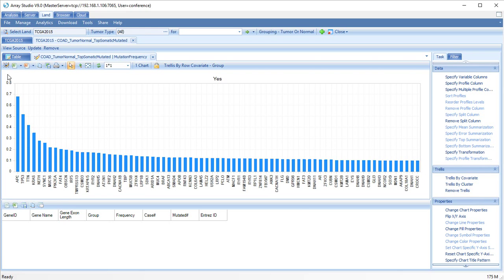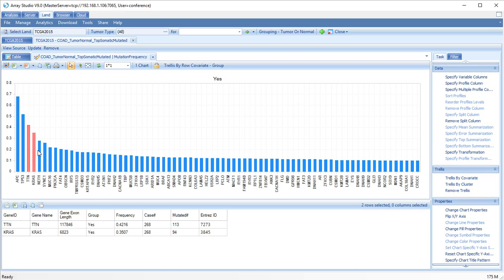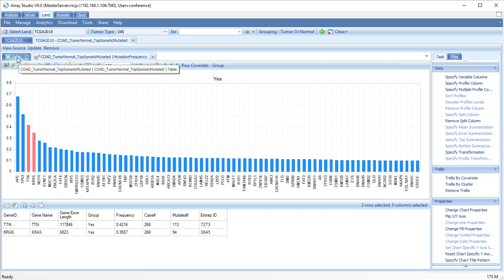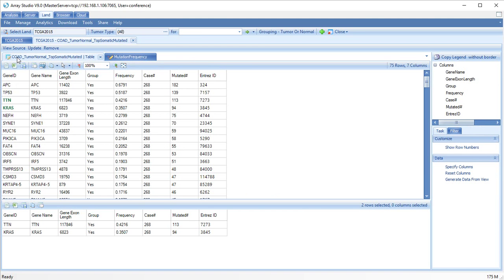You will see a plot of the ranked gene mutation frequencies, and selecting a region of the plot will show details of the analysis. Switch to the Table tab. Here, you can filter and sort to identify the most commonly mutated genes in our sample set.